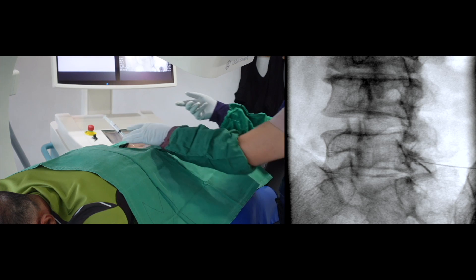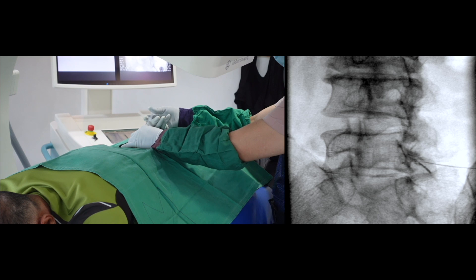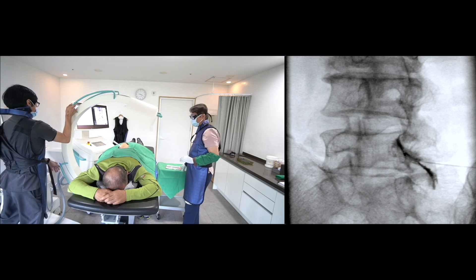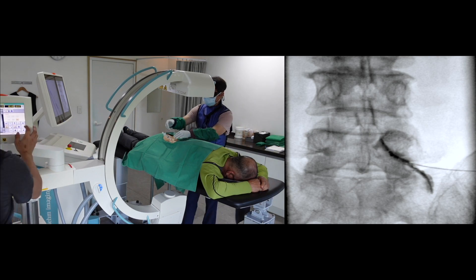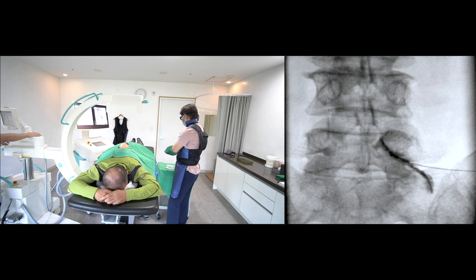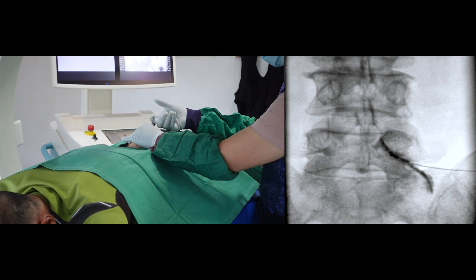Please confirm the space with the contrast media. The contrast spread looks good. I'll deliver the steroid mixture.